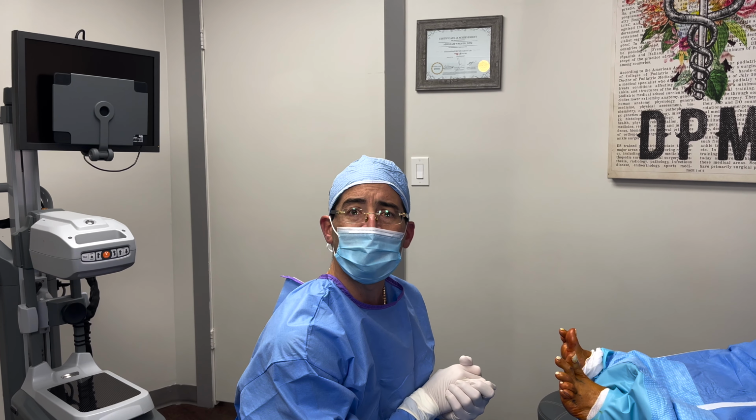A few inches later. We're all done. Beautiful transformation. And that's the beauty of this type of surgery. Office-based surgical suite, patient is awake, local anesthesia, patient walks in, walks out. No pins, screws, or plates. What you are going to see are the very delicate, intricate splinting and bandaging techniques that we will implement over the course of the next 4 weeks or so. You will see a little bit of blood. That is totally normal.